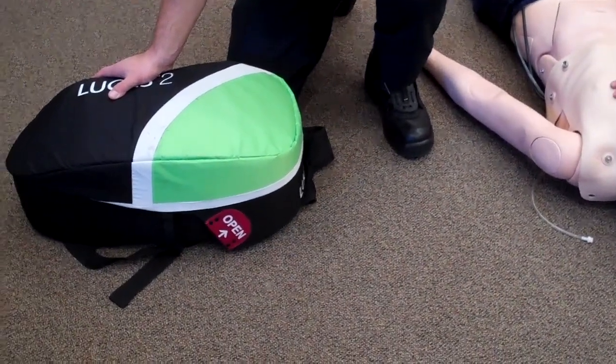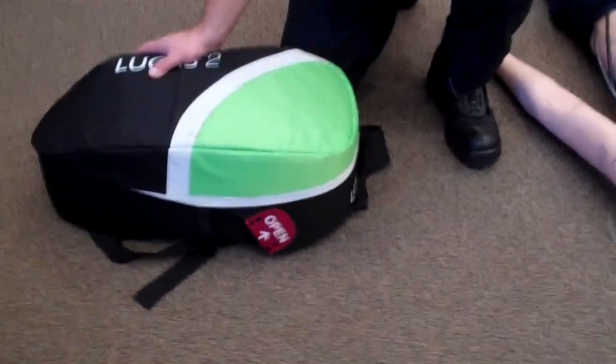Step 1. While CPR is in progress, open the backpack from the red open corner.